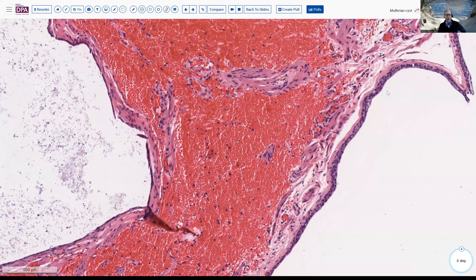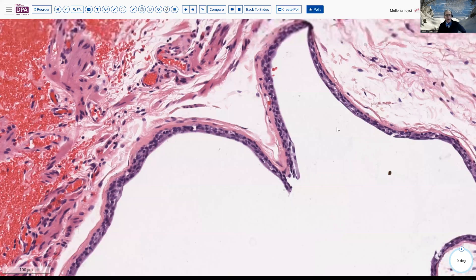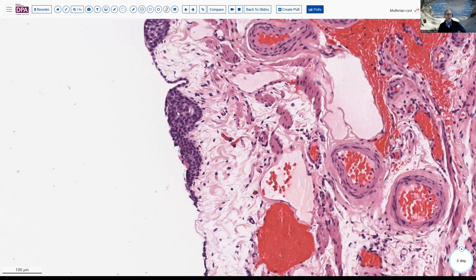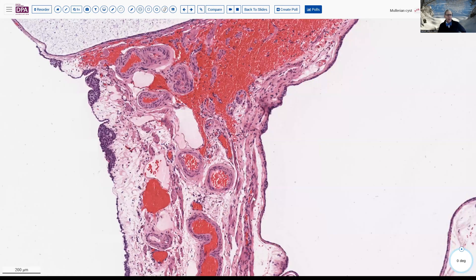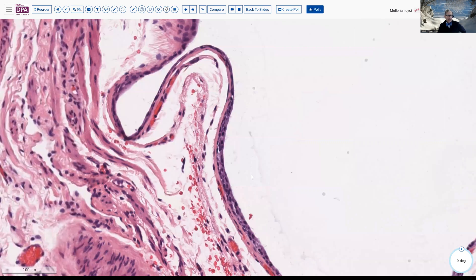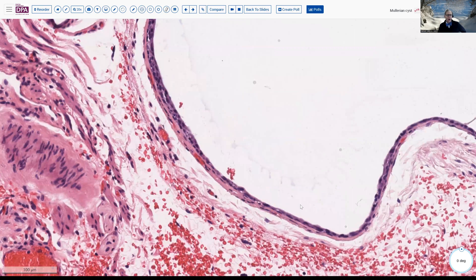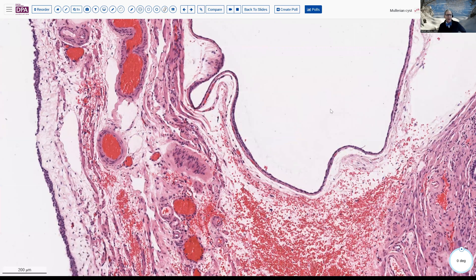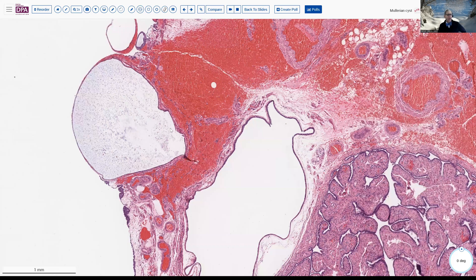We might wonder if these are just a single layer or if they're a little bit attenuated. These could be Walthard-related cysts — we have what looks like a little bit of Walthard-type epithelium with a transitional type of appearance. Alternatively, these could be Mullerian-related cysts; if they're a single layer and we find some areas of cilia, as may be present here, we might just regard this as a Mullerian-derived cyst. In most cases, I don't think we make that distinction with any particular degree of reliability, but it's nice to understand the genesis of these lesions histologically.